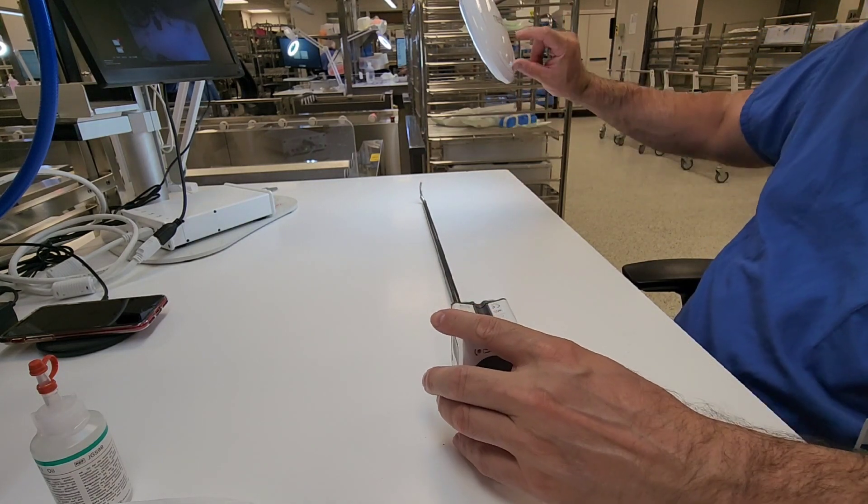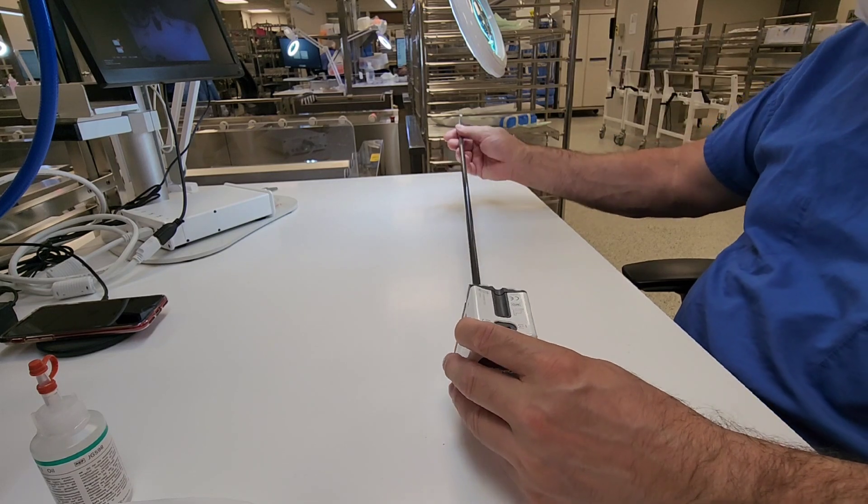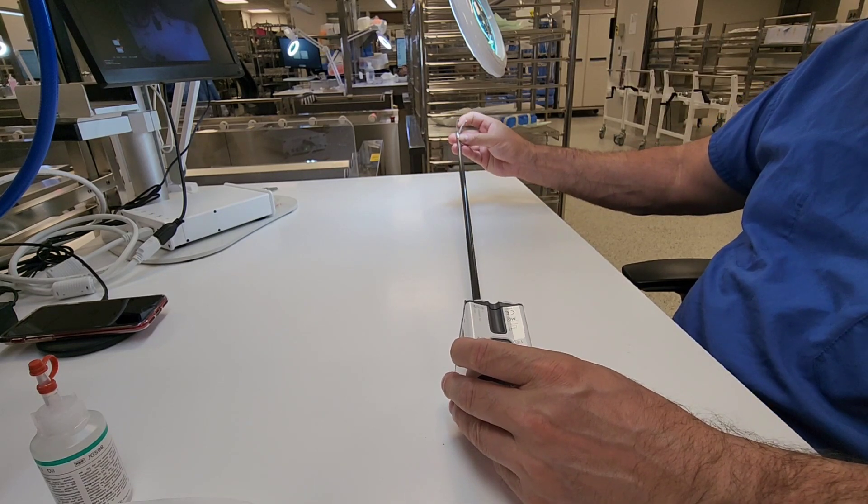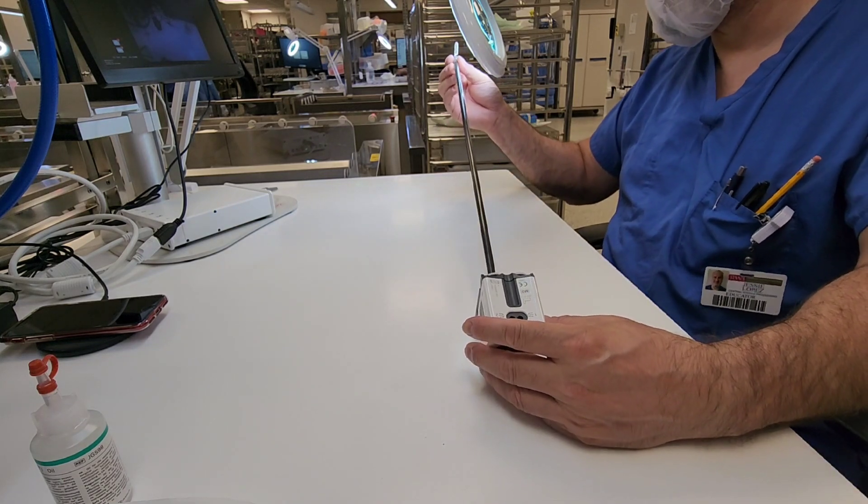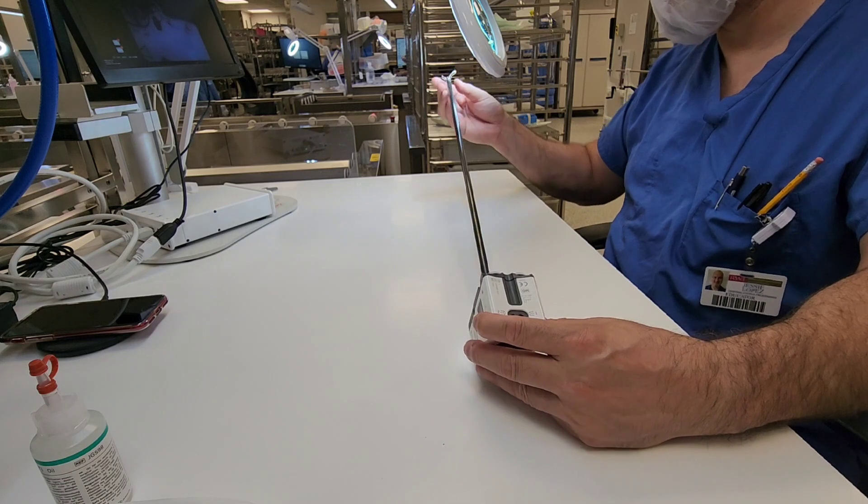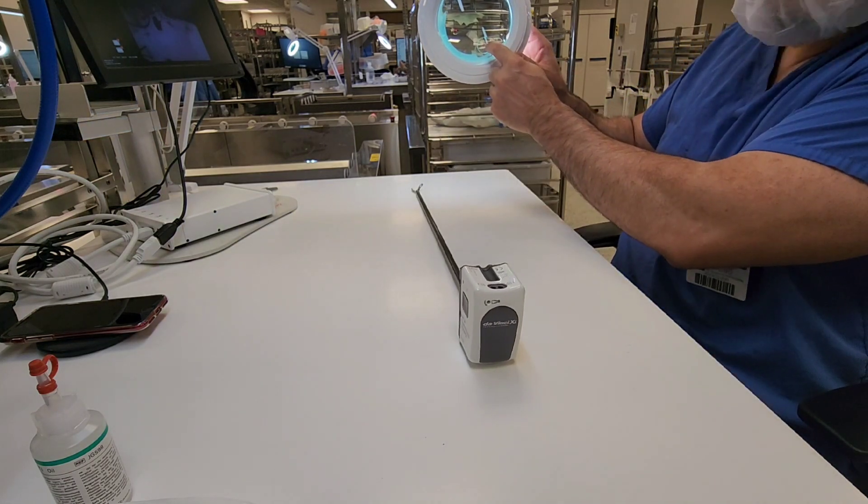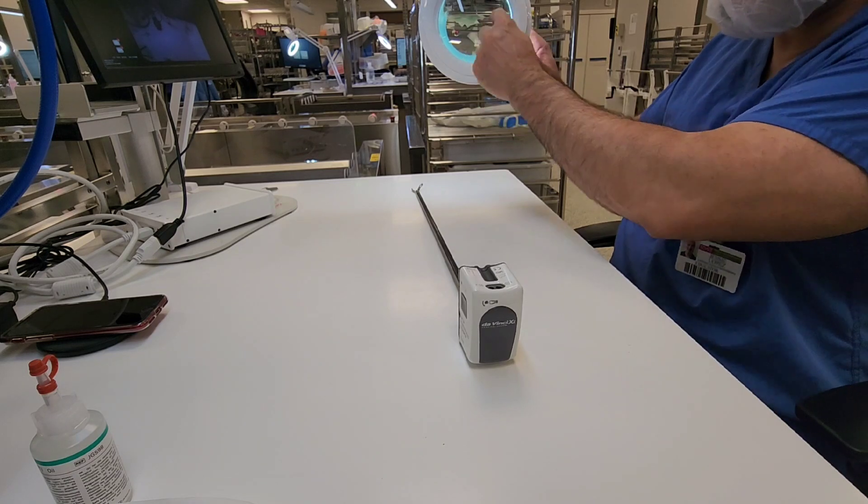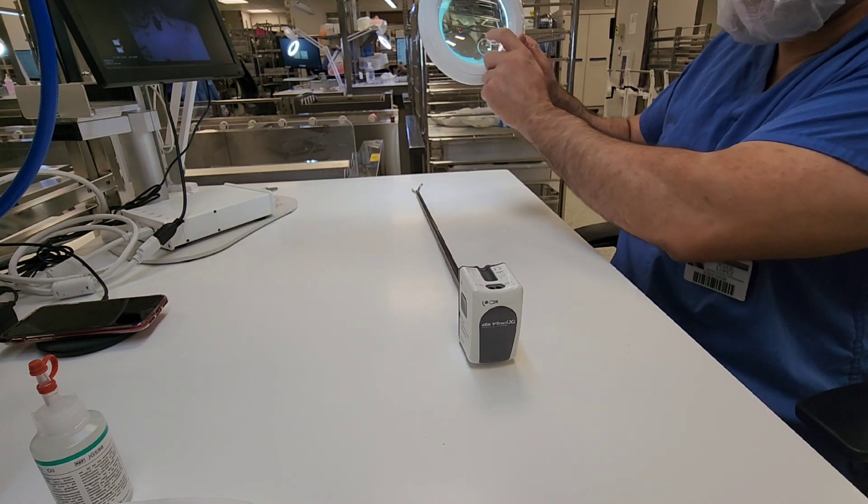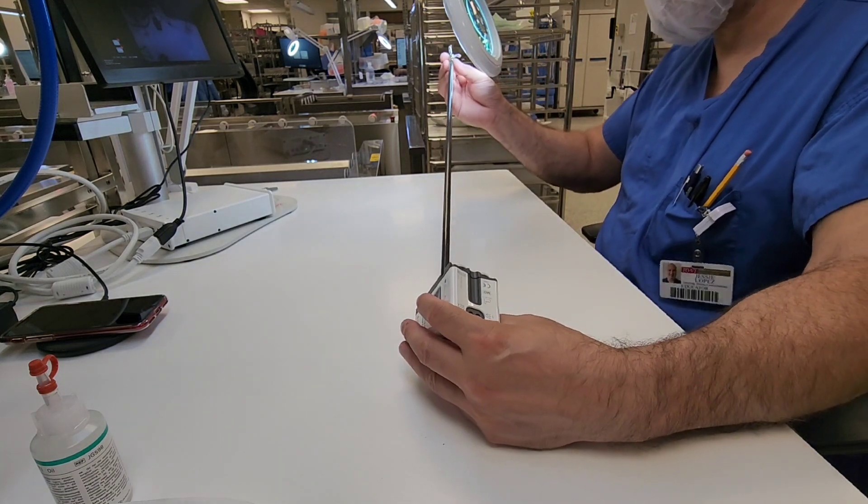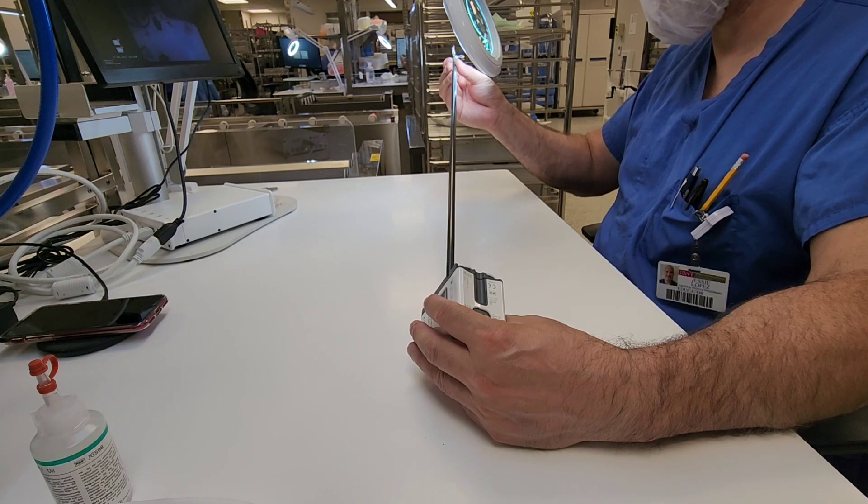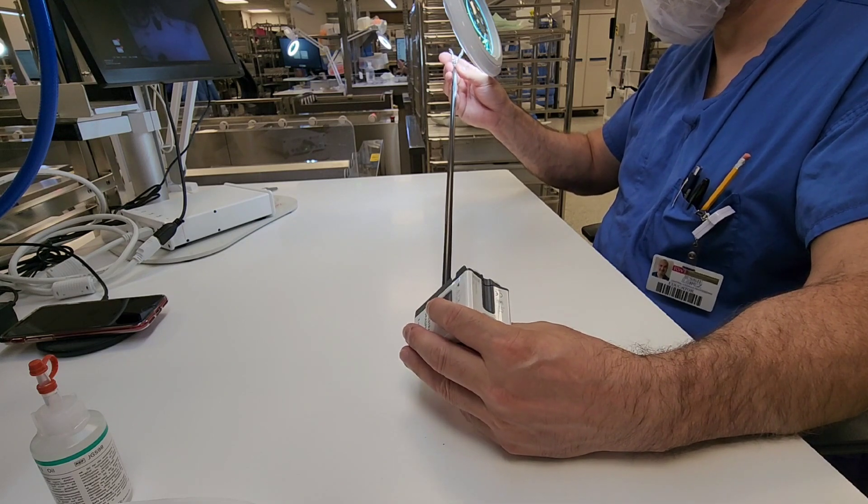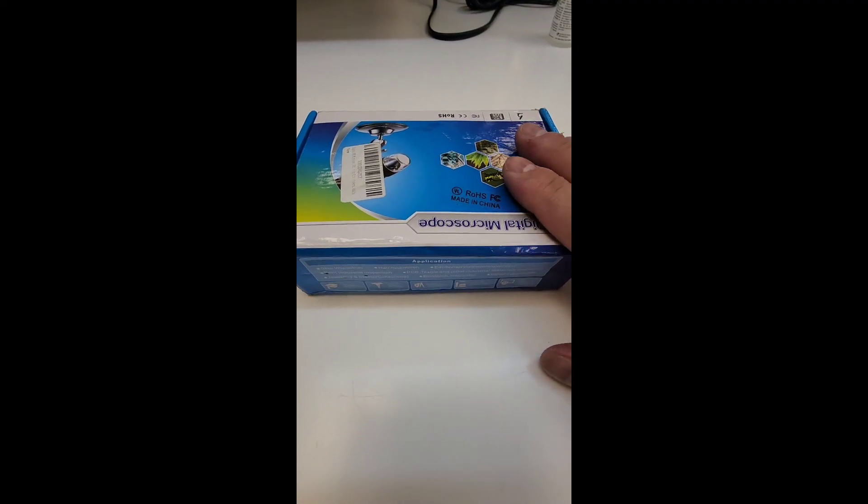If you're using a lighted magnifier that is desk mounted such as this one here, please make sure you see how much magnification is there. The majority of these desktop magnifiers only allow for one and a half to two point two five times magnification. You need four times magnification. This one here is only a two times, two point two five magnifier, but it actually has another little spot on there that gives it five times magnification, so that's acceptable.